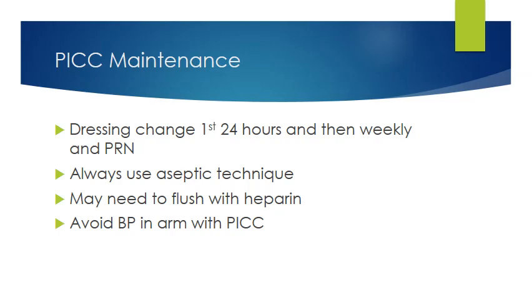When we do the peripherals, it's not sterile, but central lines, when they are inserted, it is a sterile procedure, and the dressing changes are also sterile. Now, when you go in to push medications through those lines, that is not sterile. Okay, that's just you want to stay aseptic or as clean as you possibly can whenever you do that. You may need to flush these with heparin, and you also want to make sure that you're avoiding blood pressure in the arm with the PICC in it.